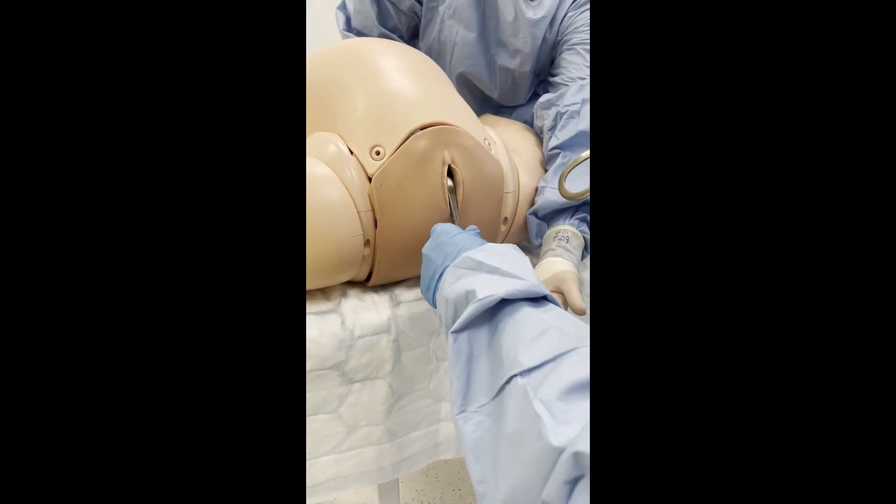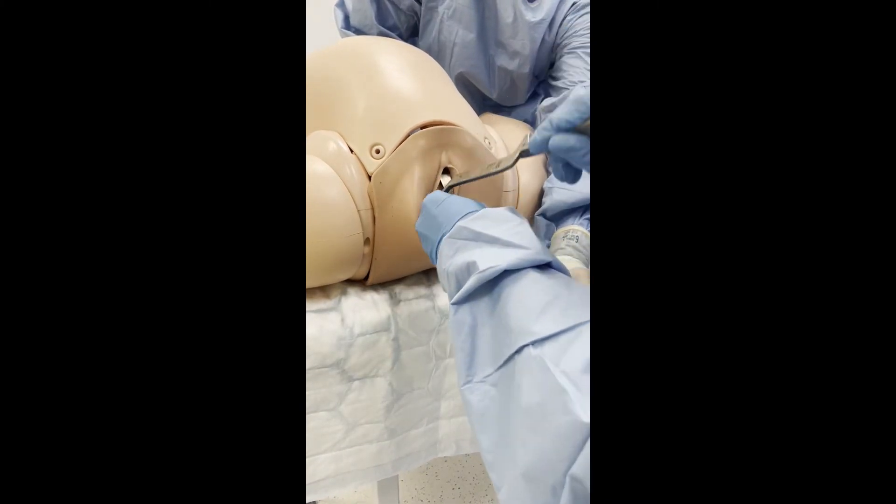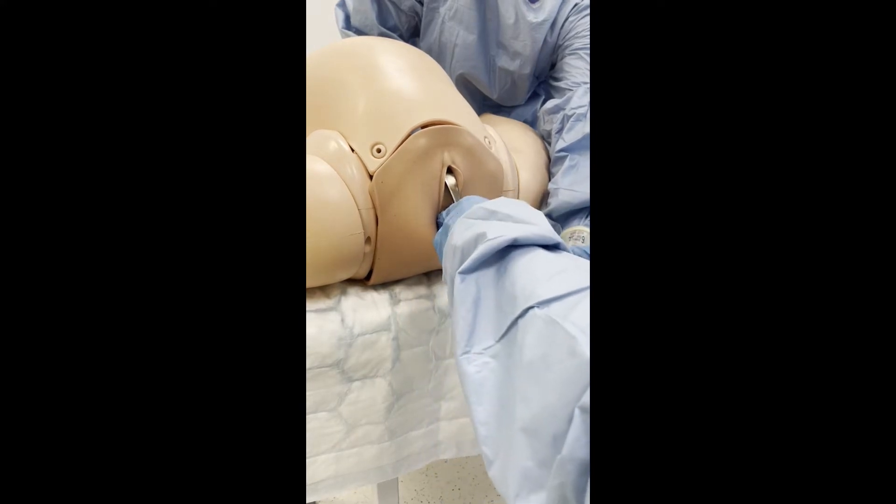The posterior forcep can be introduced along the pelvic side wall and then positioned into the posterior vagina, guided with the operator's thumb.